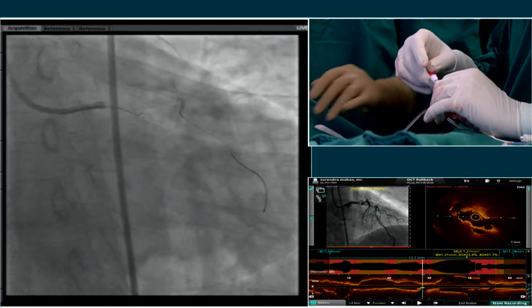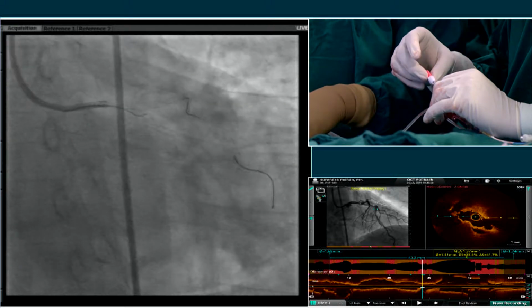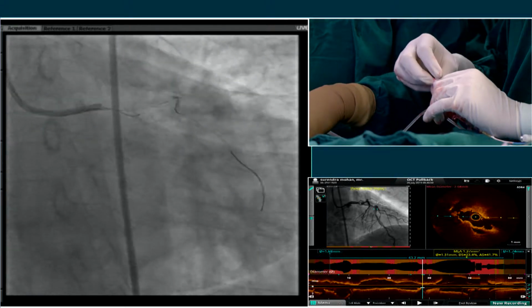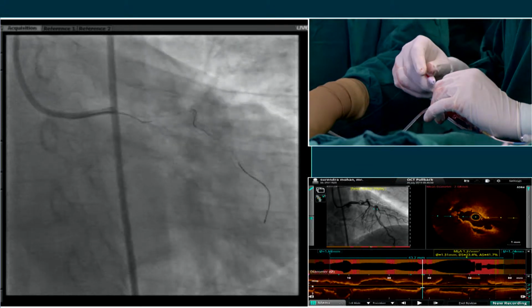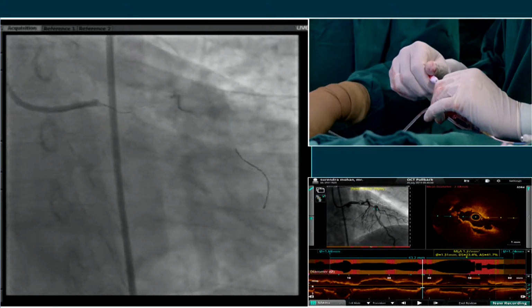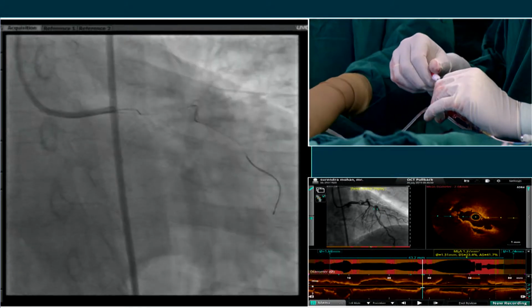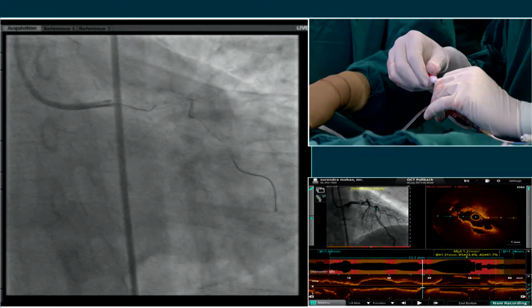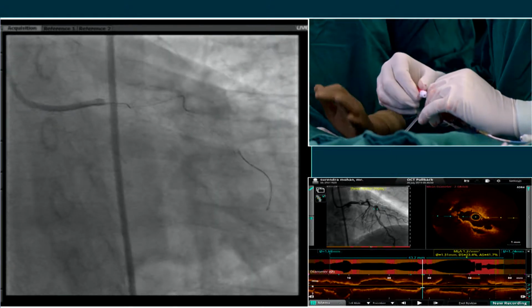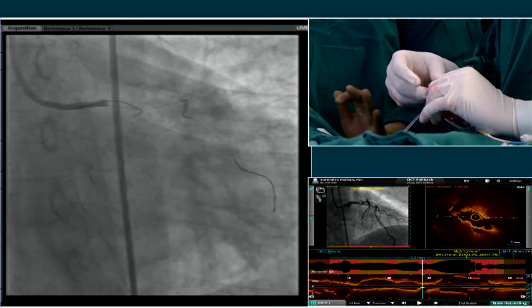This is always the most stressful part of a live case, right? Everyone's watching you trying to wire. That adds a level of difficulty that makes it nearly impossible, right? Give me one more wire.